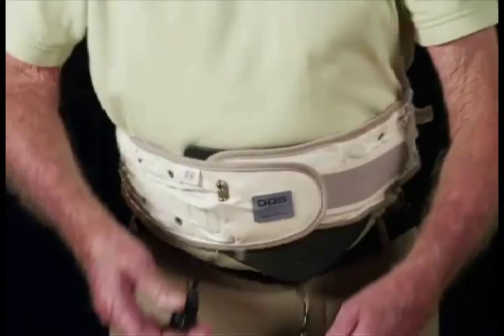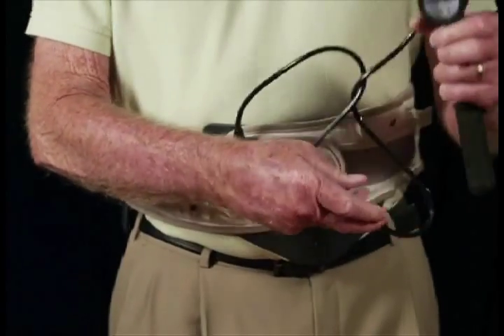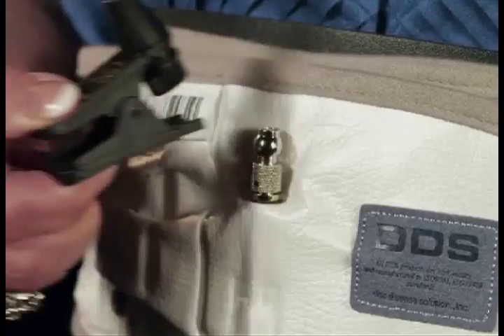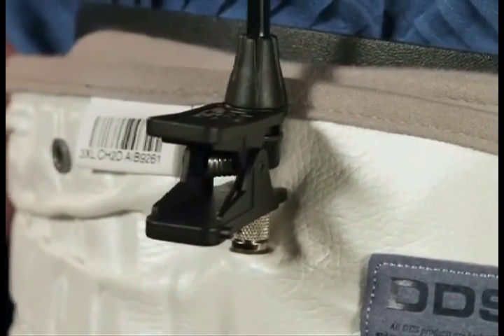Step 4. Now connect the hand air pump to the air valve. Be sure to connect the air injection tongs exactly with the air valve as shown in this demonstration.